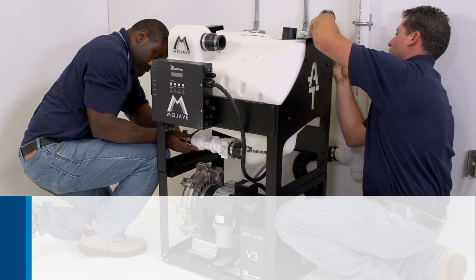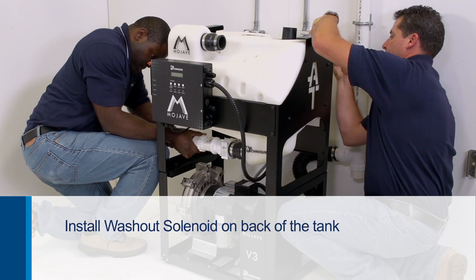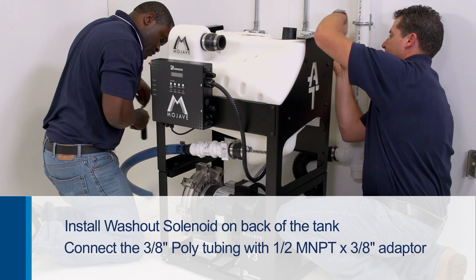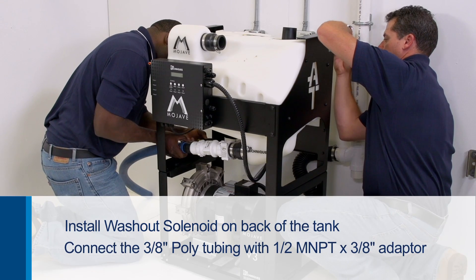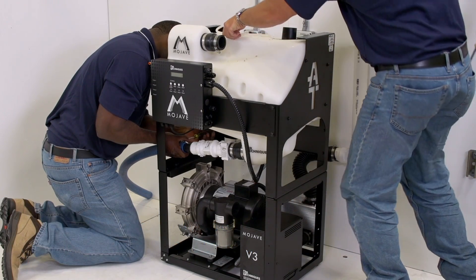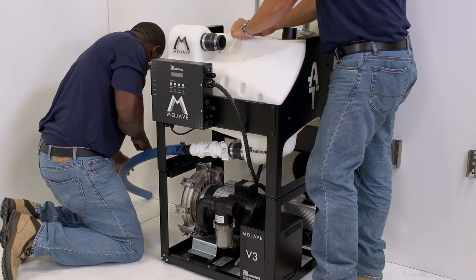In the meantime, the other installer should work on installing the washout solenoid on the back of the tank, making sure it is secure, and then connect the 3⁄8-inch poly tubing with the ½-inch MNPT 3⁄8-inch push-to-connect adapter. This will connect the washout port on the top part of the tank to the water supply.